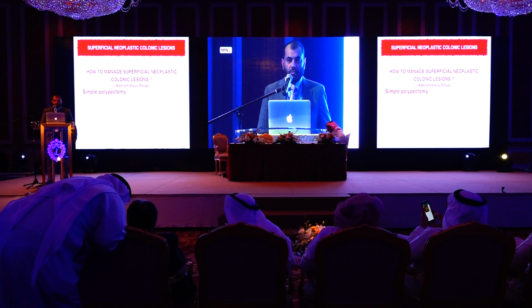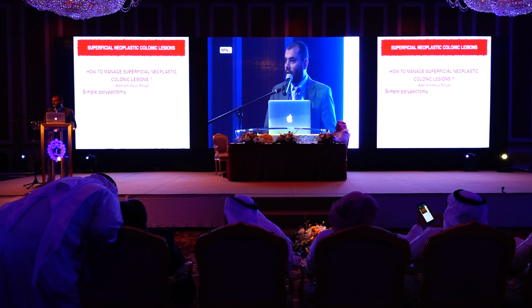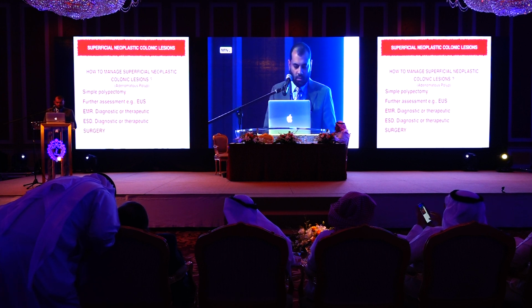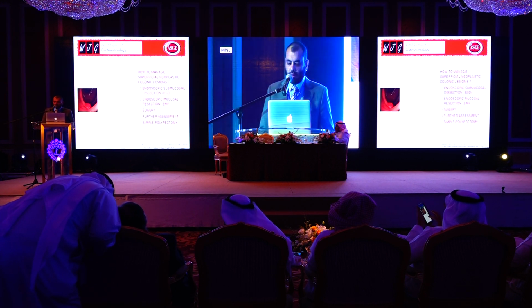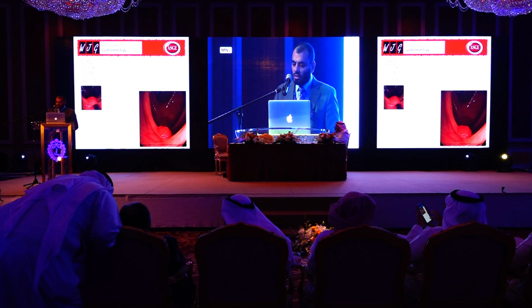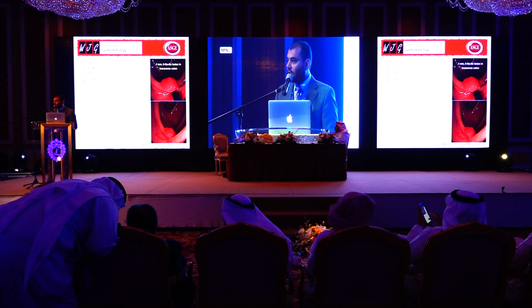...be further assessment like EUS, more advanced techniques like EMR or ESD, and surgery could be the ideal option. So how can we manage this lesion? The lesion was located in the transverse colon. Endoscopically, a flat elevated lesion with a central depression, and macroscopically it is 0-IIa plus IIc.